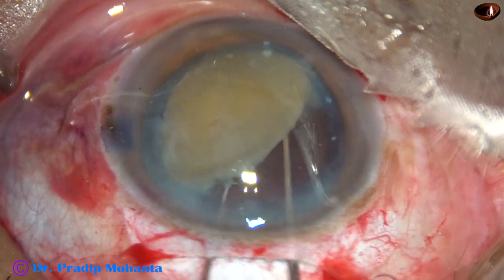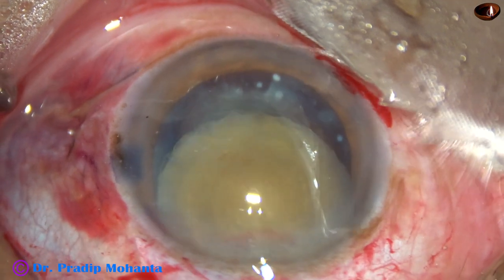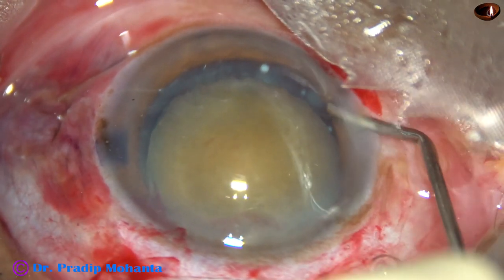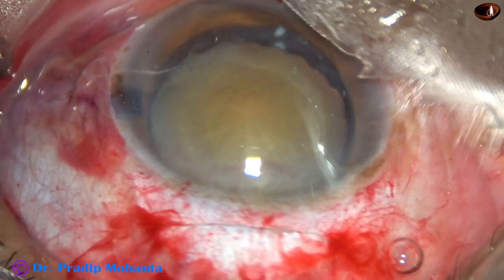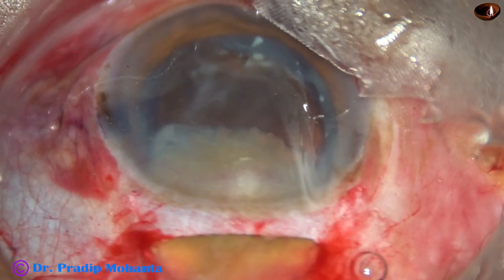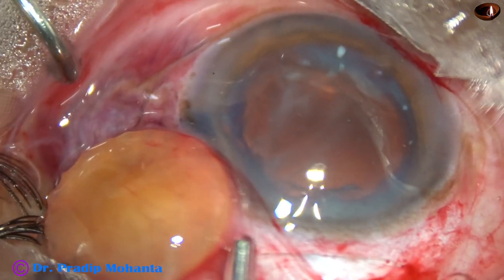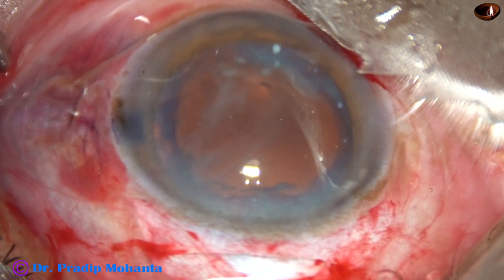I have placed one equator at the tunnel. Now I inject visco from the side port, depress the posterior lip, and gently it comes out. So this is called visco expression — I injected visco through the side port, depressed the posterior lip of the main wound, and the nucleus has come out.